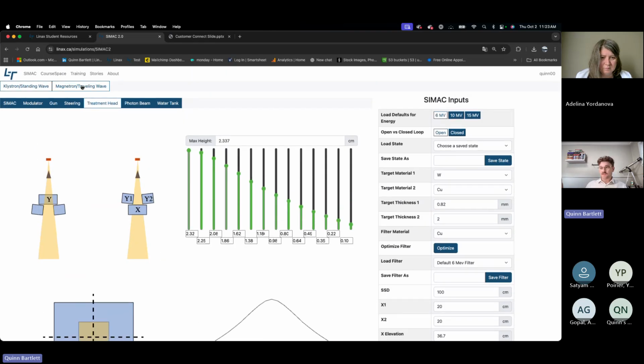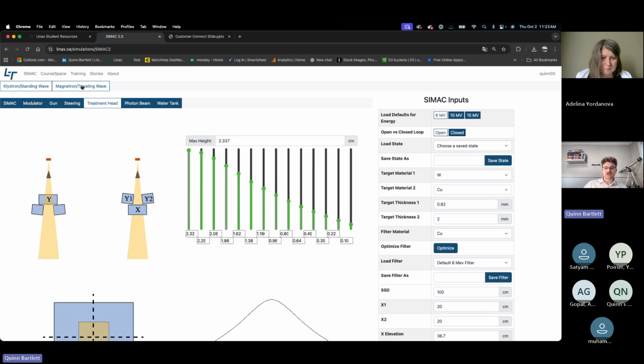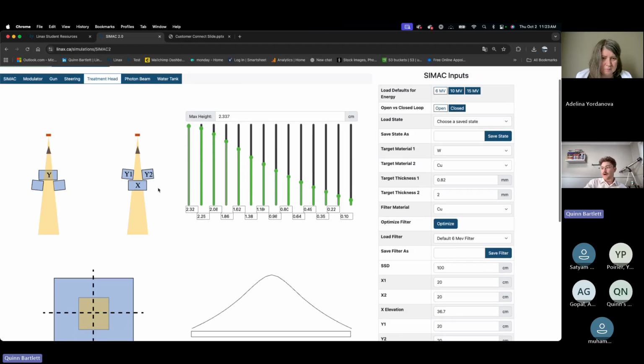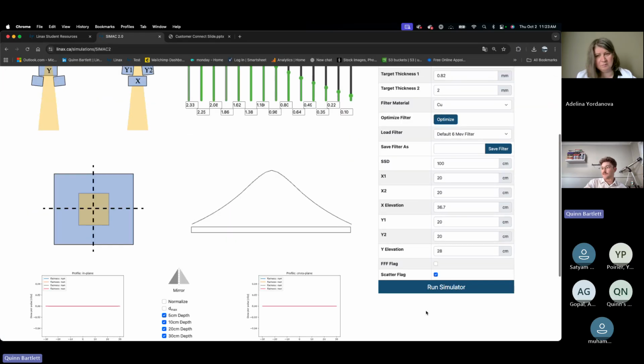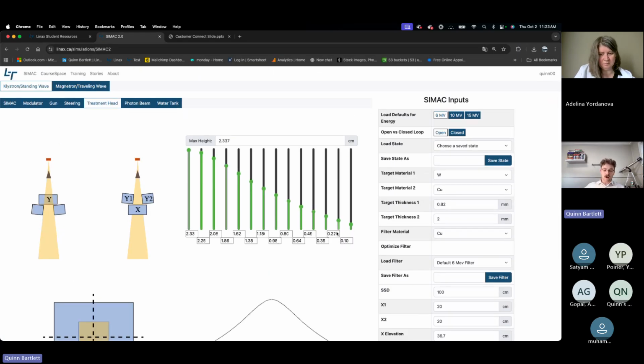But as a service engineer or somebody in that position, we could definitely find those values that were a little bit closer to the ones that would create that asymmetry and then allow you to steer it back to normal, right? Because what I can at least show you is that the steering factor is definitely a usability of Simac.